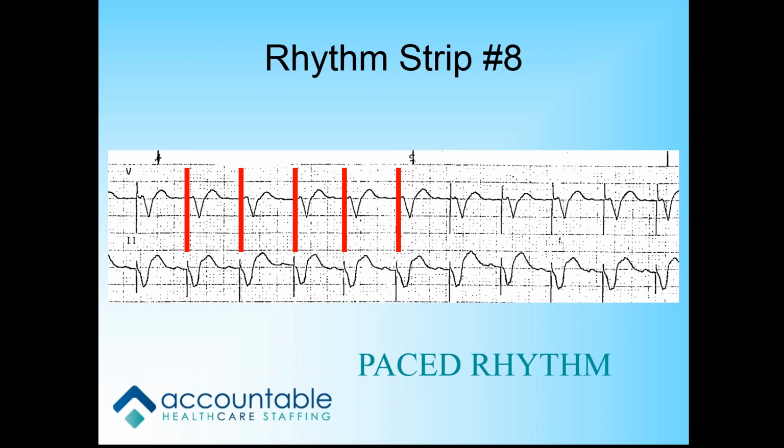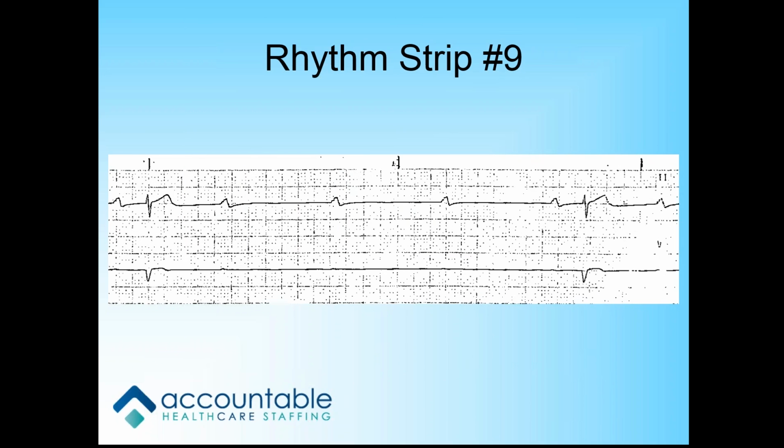And then Kristen, next. Okay, you ready to go on a block? I guess if I have to. I had this patient. Yeah, it was an exciting day.